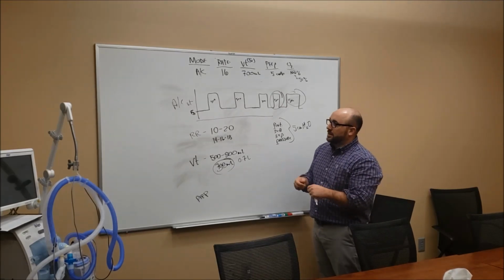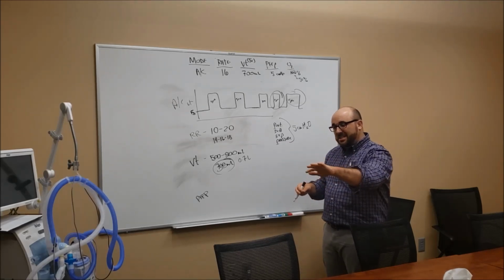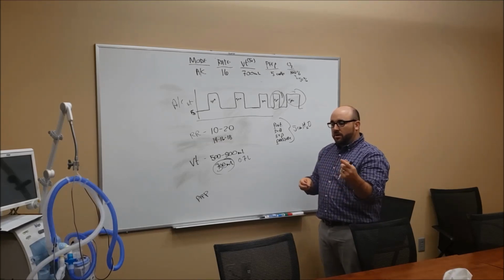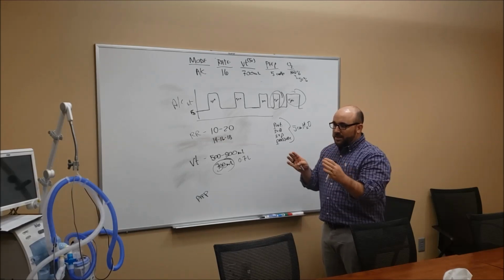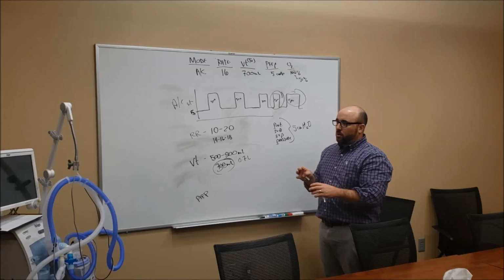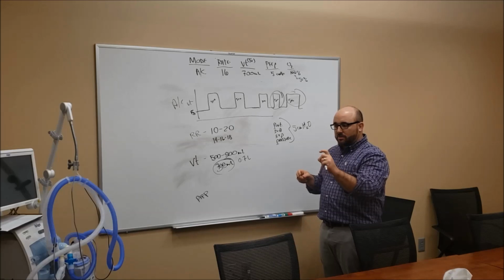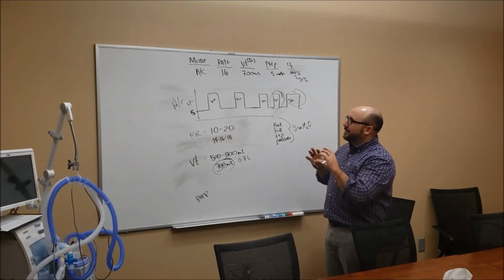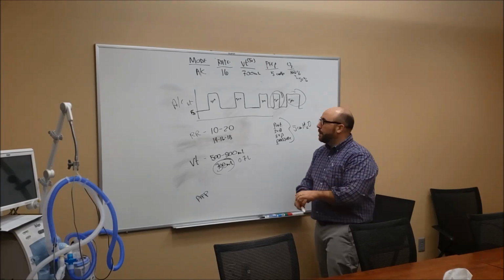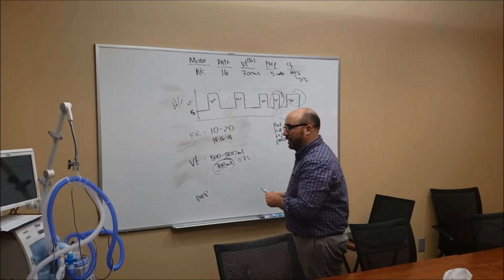If they're a patient that is chronically hypoxic, like an end-stage COPD, we might go into the 86, 88 or up, or try to keep them on the low end. But yeah, so 94 to 100, 90 to 100, anywhere in that mid to low 90s is usually good. We usually just don't want it reading 99 or 100. If it's 98, 99 or 100, we start weaning the oxygen down. Not something you're going to do a lot down in the ER, but this is what's going to happen when they go upstairs. So, all right, let's see what this looks like on our ventilator.